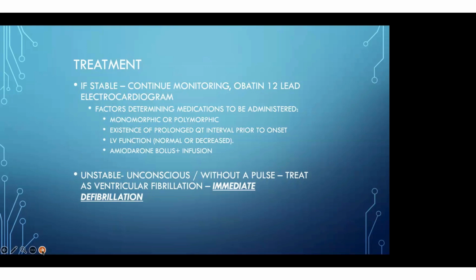There you have to look at the initiating event, if you get an ECG of QT prolongation just prior to initiation of VT. In that case, it is usually drug-induced or a dyselectrolytemia. These two you usually have to rule out, because inpatients usually collapse fast with an arrhythmia. In that patient you will usually find diarrhea, magnesium depletion or hypokalemia.